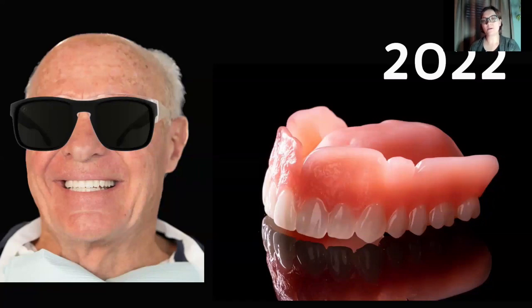And so this was one of the newer high impact resins that was released in 2022. And you can see that we've really improved some of the aesthetics. The teeth look a lot more natural. One of the things I think is the coolest about printed dentures, if you look at the anterior area of this, you can see that they've done a lot of stippling. We've really characterized the anatomy from the canine eminence and around the frenum and the gingival margins.